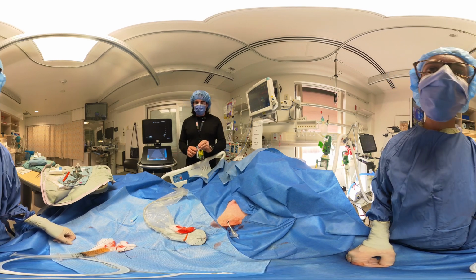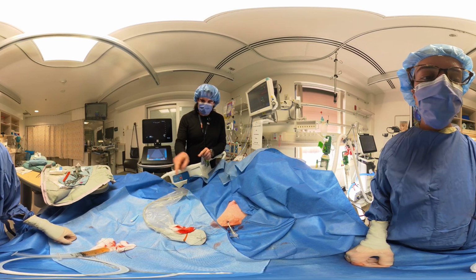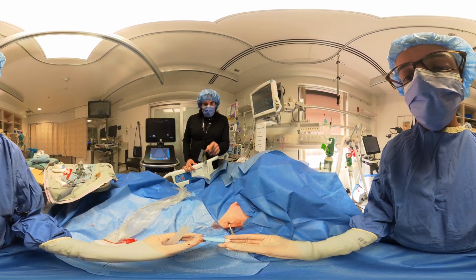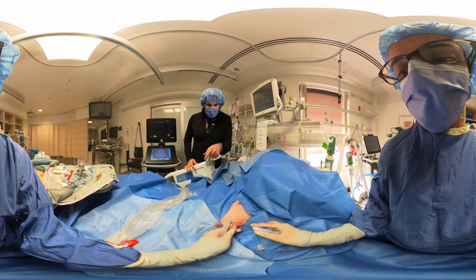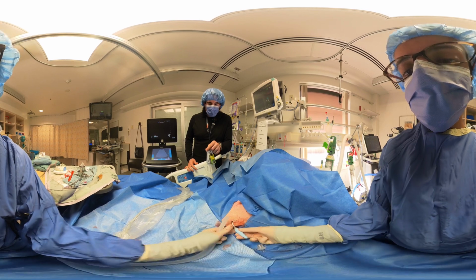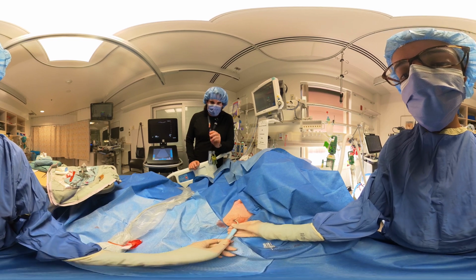So actually the next step we're going to do here is, once I bring the Pleur-evac, we're going to disconnect the stopcock and attach the Luer-locked Christmas tree. That's the white to blue device. Okay. So here you are going to take off the stopcock, attach the adapter. Okay, so attach that one. Yep. That's a Luer lock device. Now you're going to take the tube and put it right over the Christmas tree adapter. That's what I call it. I don't actually know the official name, but there you go.